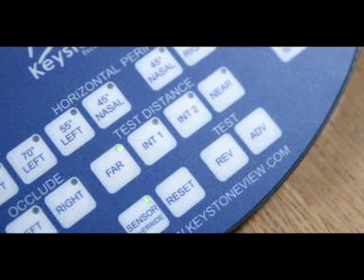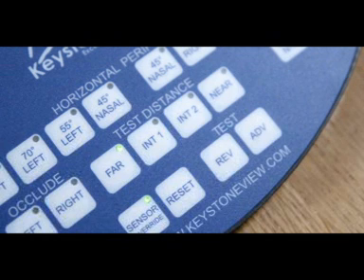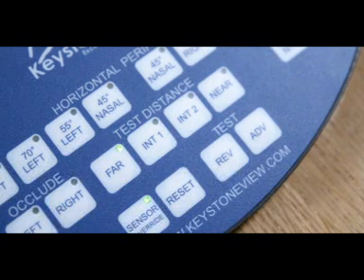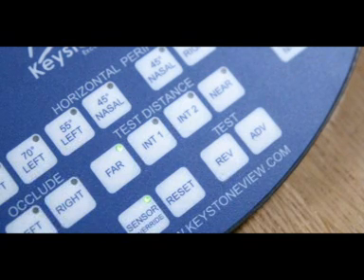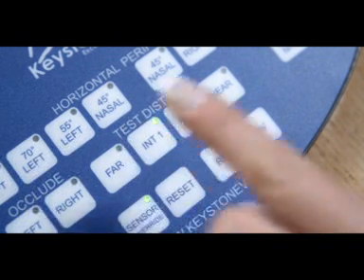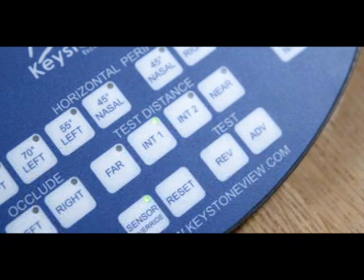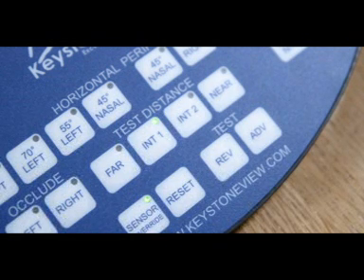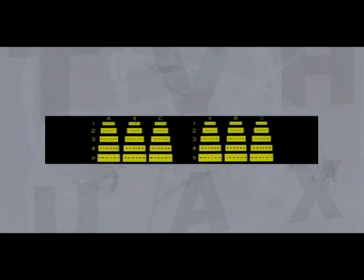To move on to the next test, test I1, you do not need to press the advance key. Instead, press the INT1 button on the control panel. You now need to switch to day on your control panel. This test is optional for those who use workbench tools. It should be conducted in the same way as test F4 but reading down column B.